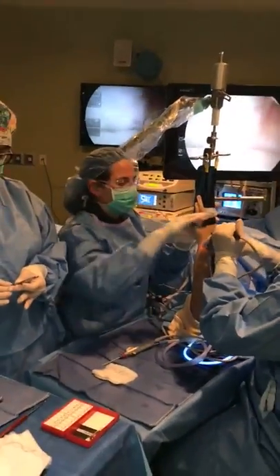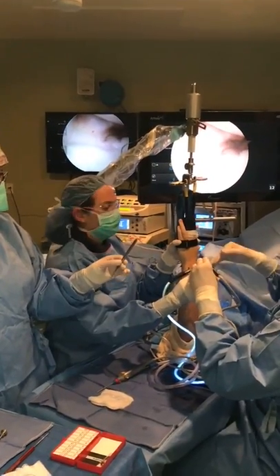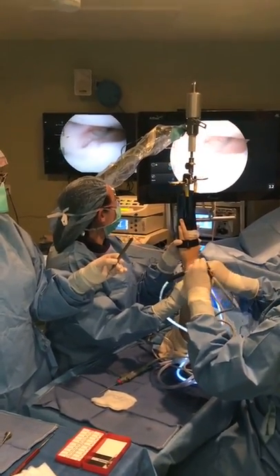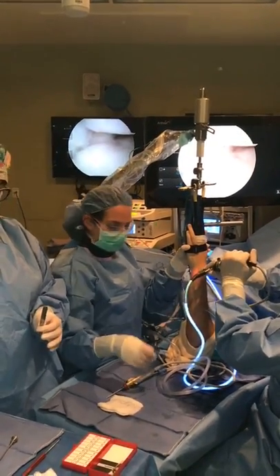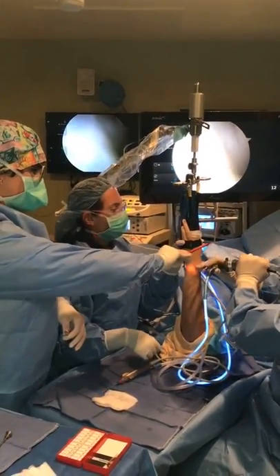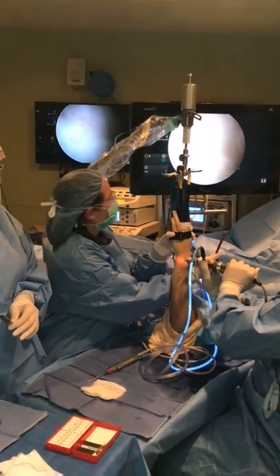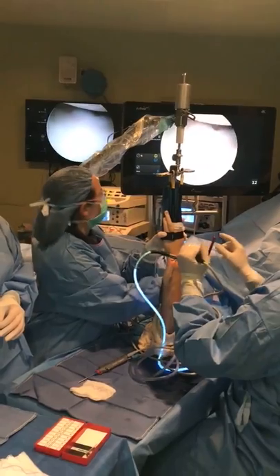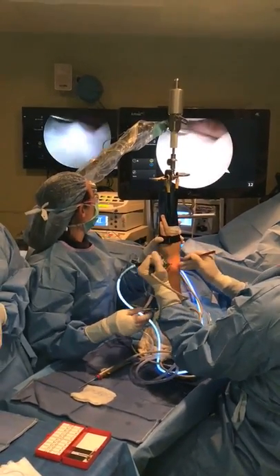Okay. All right, so this is a different perspective of the wrist now. We're now in another portal. It's called the 6R portal. So I need to look at the probe first. Yeah, there's a detachment right there. Okay, so here's a probe.